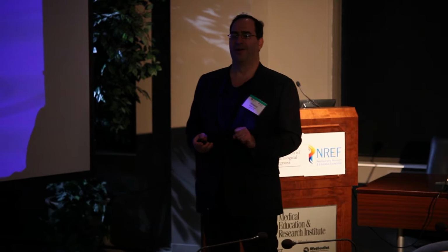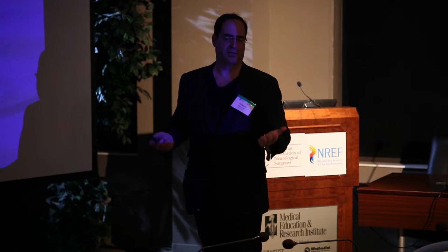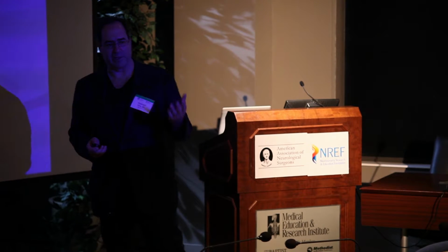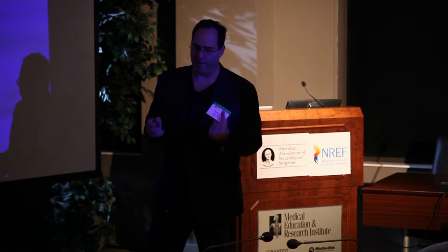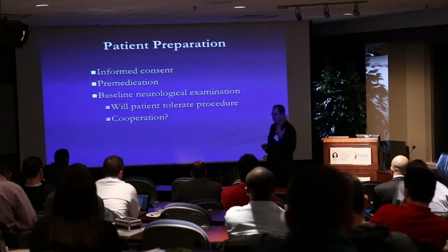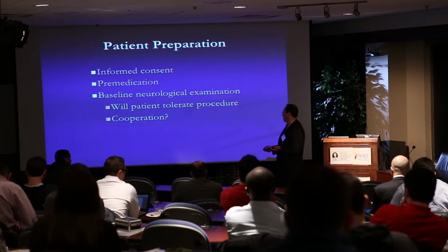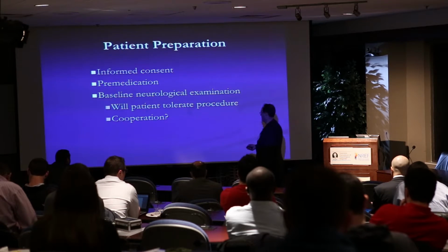Sometimes when I've asked the anesthesiologist to do conscious sedation for me, their idea of conscious sedation is a little bit deeper for the patient, but the patient is still moving and I don't get the images that I like. I like really crisp and clean images, and so a lot of effort is taken, at least in our setup, to really get the best images that we can so we can make decisions off of that. And like I said, is the patient going to cooperate?